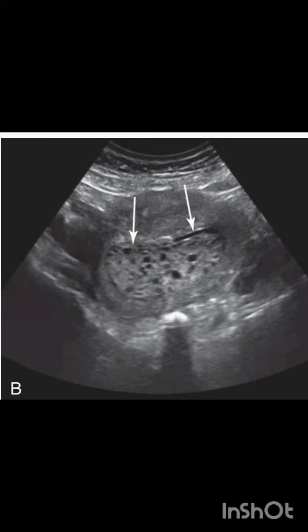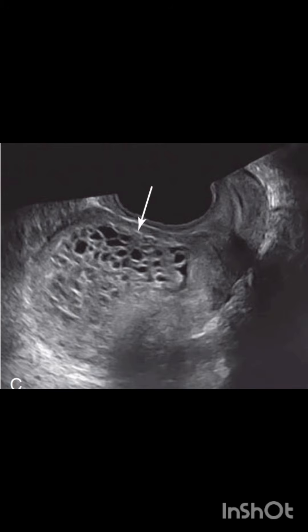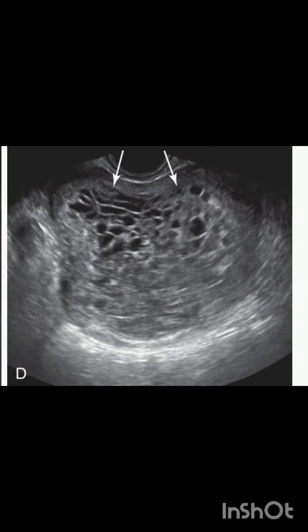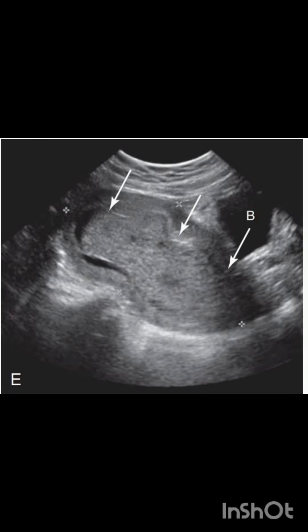The gestational sac is either absent or replaced by abnormal trophoblastic tissue. This image shows enlargement of the uterine cavity due to a mass filled with innumerable small cysts — a classic sign of a molar pregnancy. Another image again shows an enlarged uterus due to a mass with innumerable small cysts.